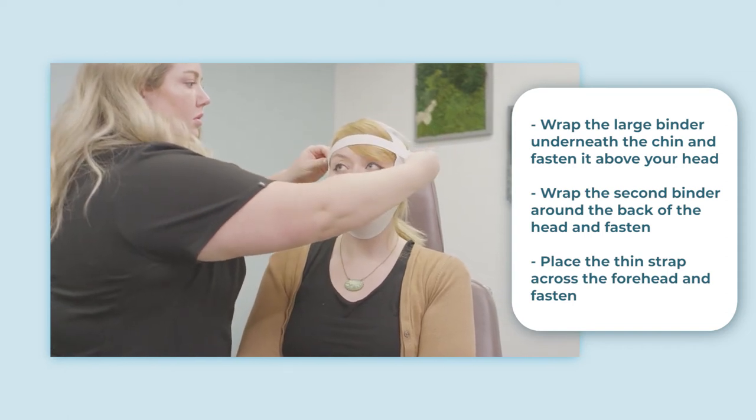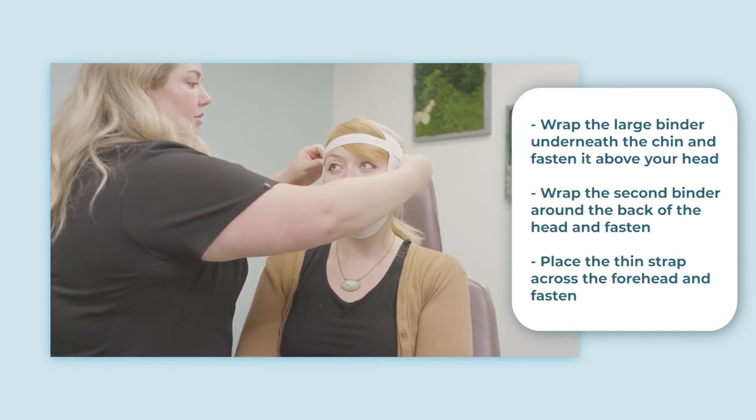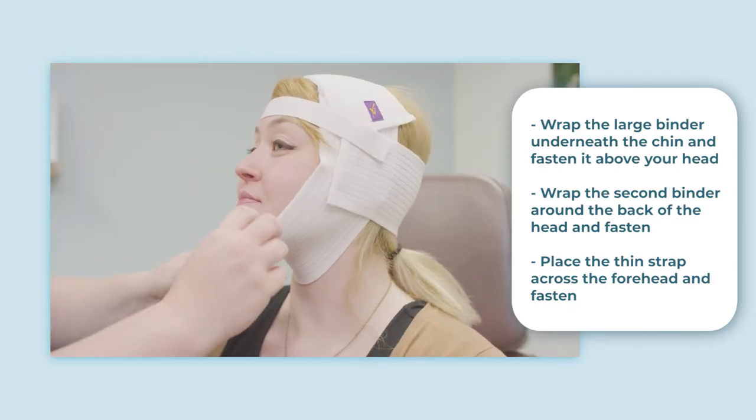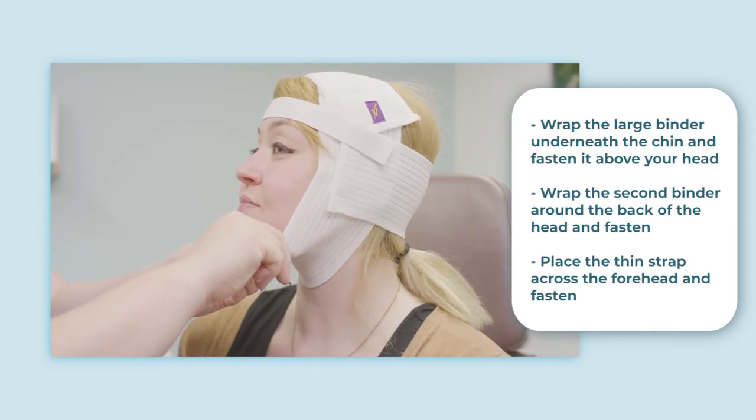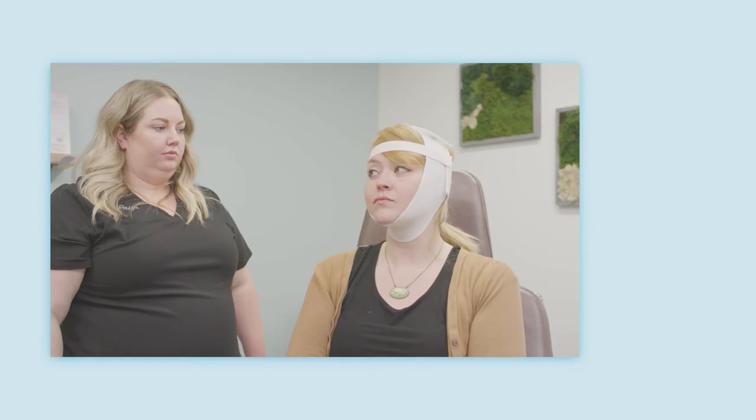Make sure your facial compression garment covers your incisions and the entire surgical site and that there are no folds. Your compression garment should be tight but comfortable enough to allow you to insert two fingers underneath. Additional comfort can be achieved by wearing a thin cotton headband underneath to protect your ears from irritation.